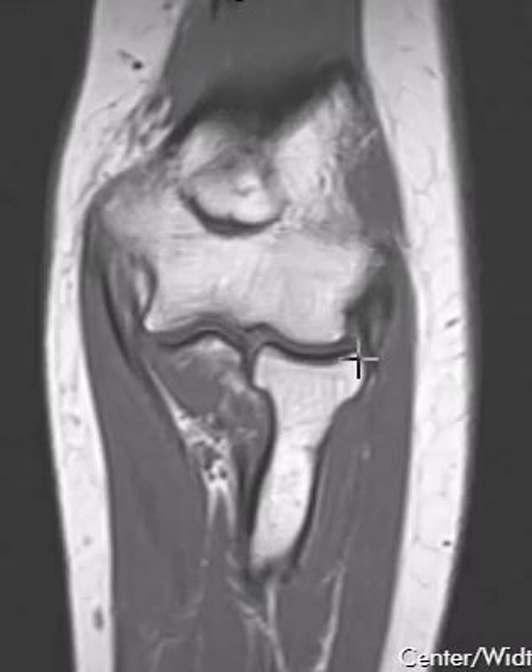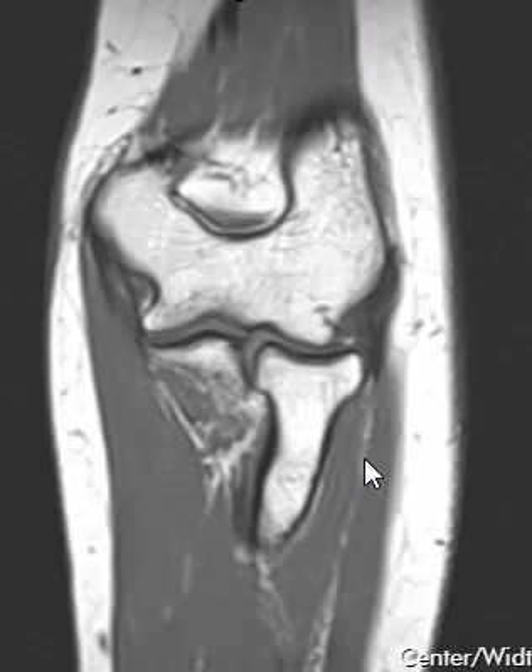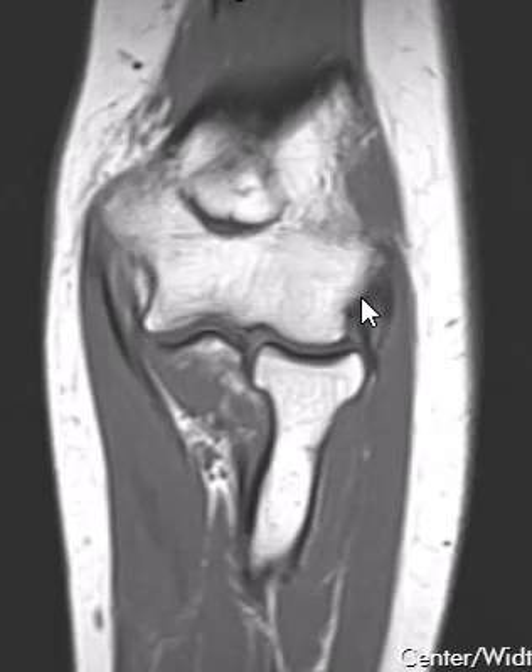Now we're going to go back to the middle cut. We have the inner side of the elbow joint where the body would be, and over here is the outside of the elbow joint, where the common extensor tendon is located. If we follow this gray muscle — all this gray is muscle — we follow it up, and it all comes together to a common extensor tendon right here, which attaches on this bone.